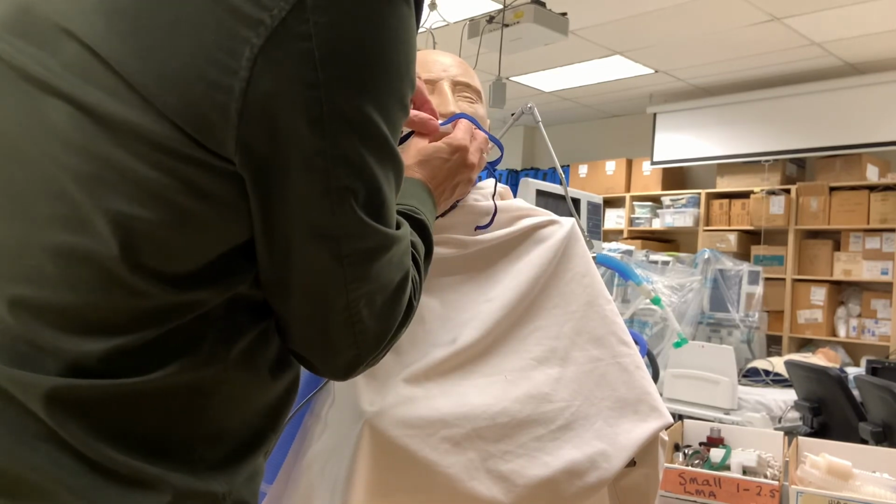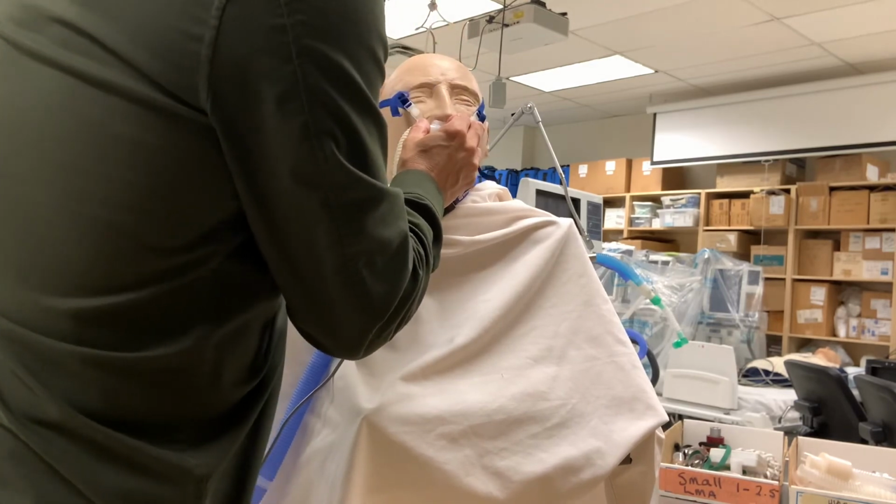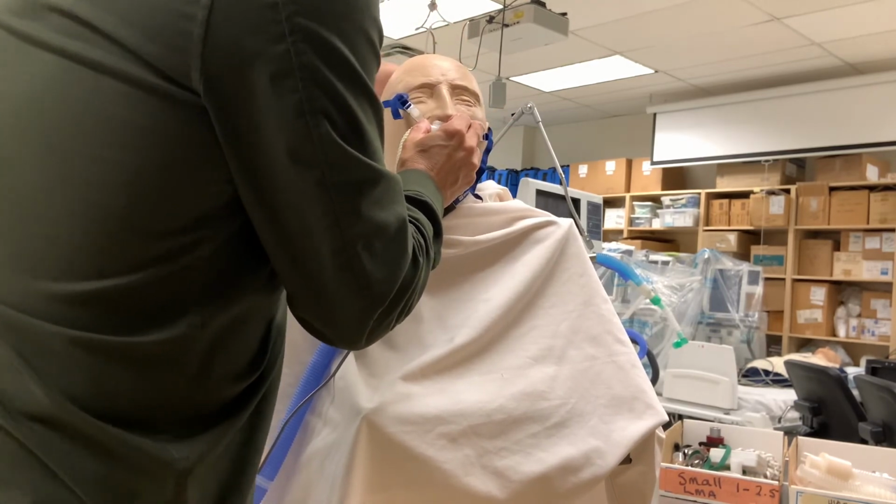Once I position the prongs comfortably in the patient's nares, I use the second strap to secure the nasal cannula in place.